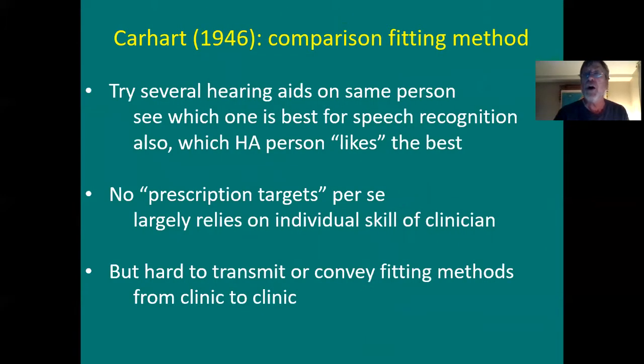Okay, Carhart, 1946. Raymond Carhart. Carhart's notch, otosclerosis, the father of audiology. How did he prescribe hearing aids? He tried several hearing aids on the same person to see which one was the best for speech recognition.